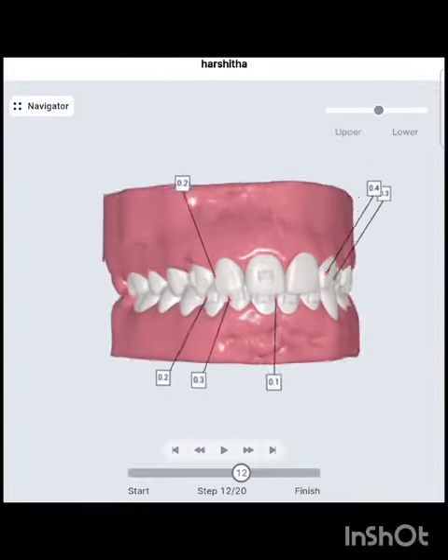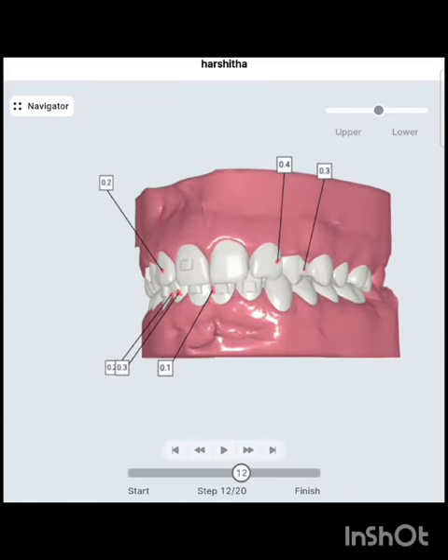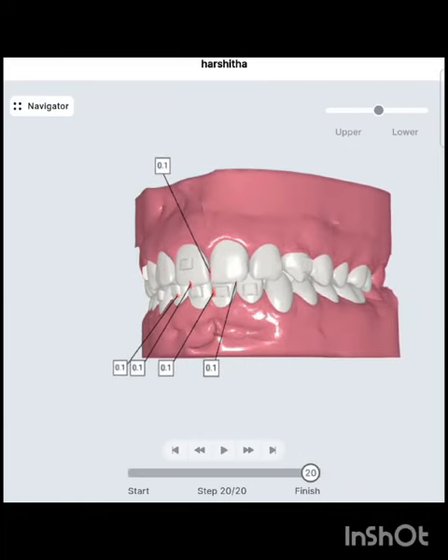You can appreciate the attachments and the interproximal reduction, or IPR, that has been programmed into the plan.